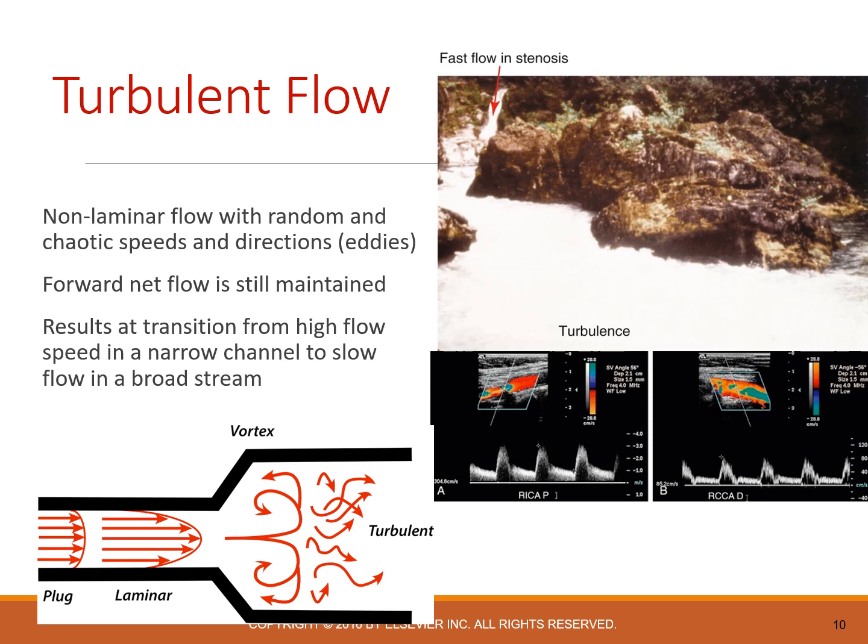Okay, so here's an example of turbulent flow. So turbulent flow is when we have lost that laminar parallel orientation, and now we are getting cells that are turbulent, just like we see here in this waterfall. Here we have nice laminar waterfall flow. When it hits the bottom of that waterfall, all of a sudden those water molecules are going to start turning and running into each other in this very irregular pattern. Well, the same type of thing is going to happen in our vascular system.